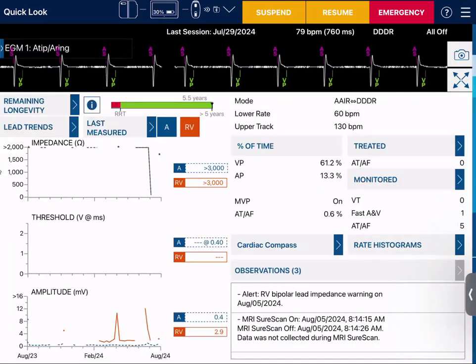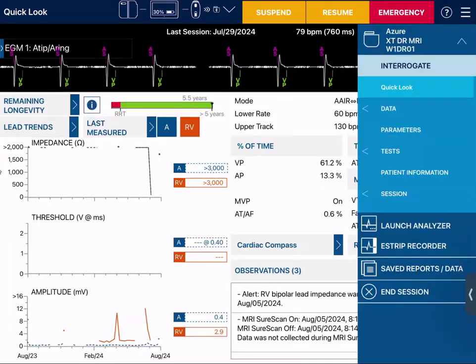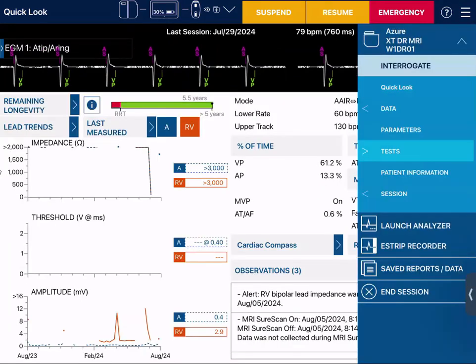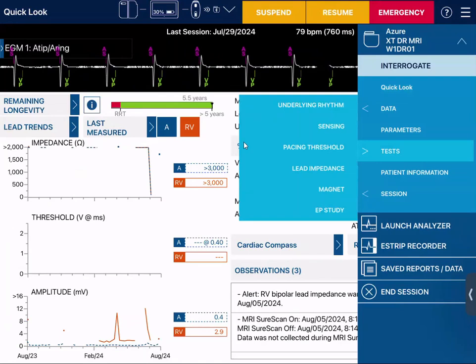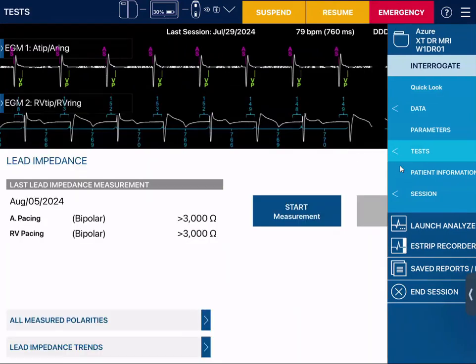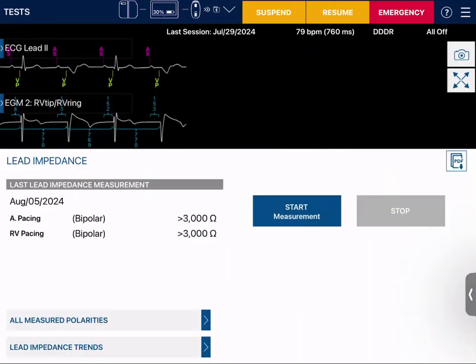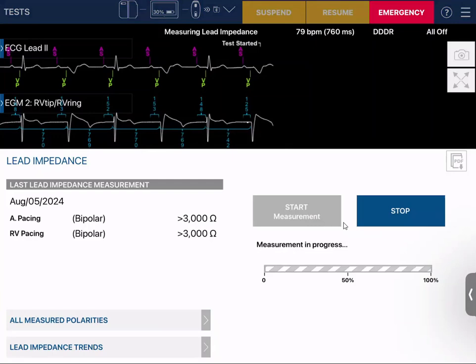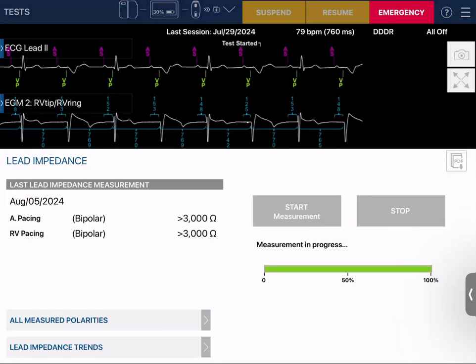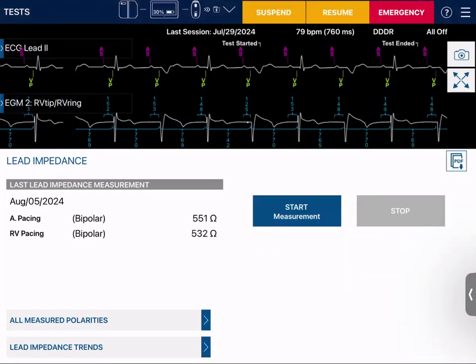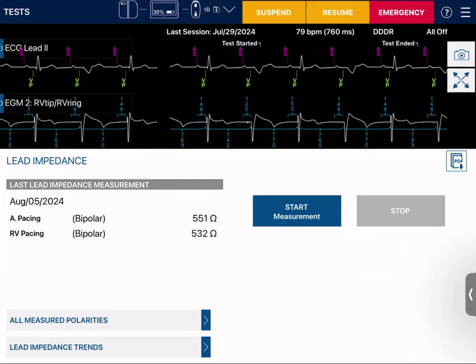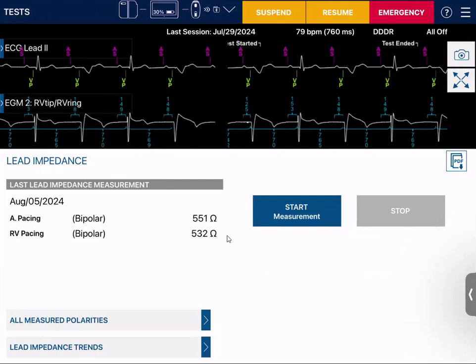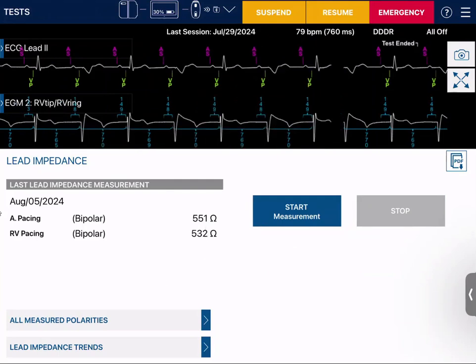Then I'm going to start with my tests and do my lead impedance test. I click on lead impedance and hit start measurement. It's going to give me lead impedance measurements, and those should be similar to what the device has measured prior.